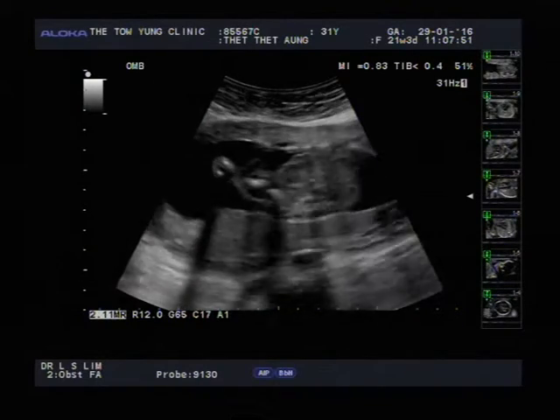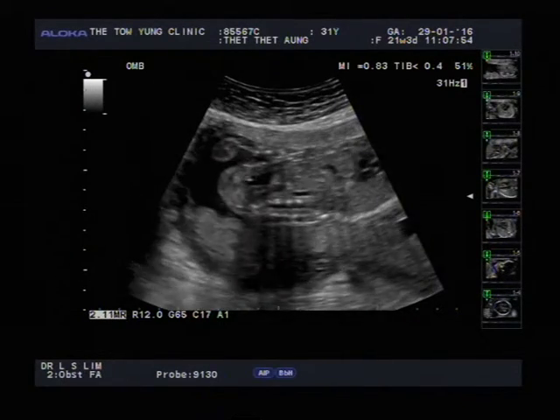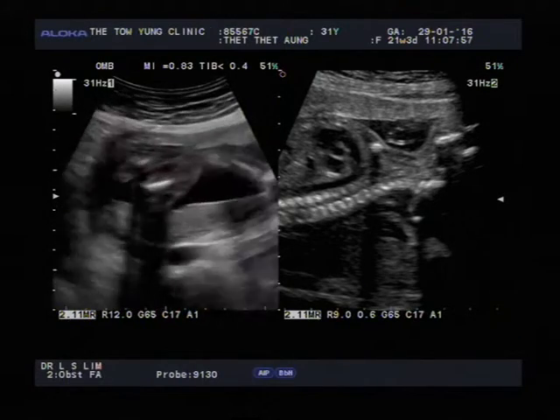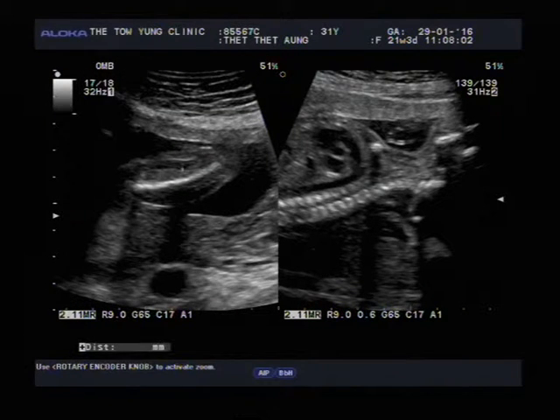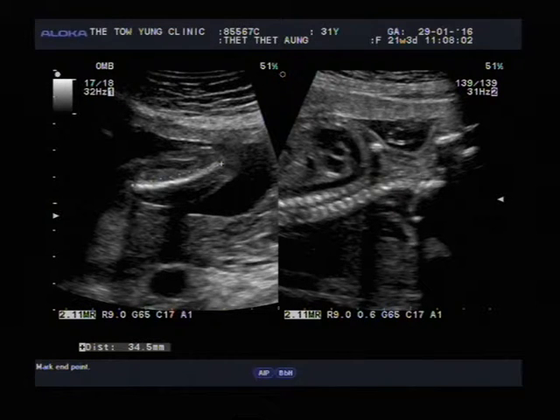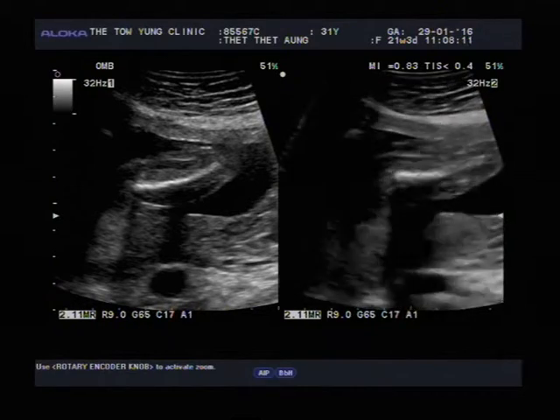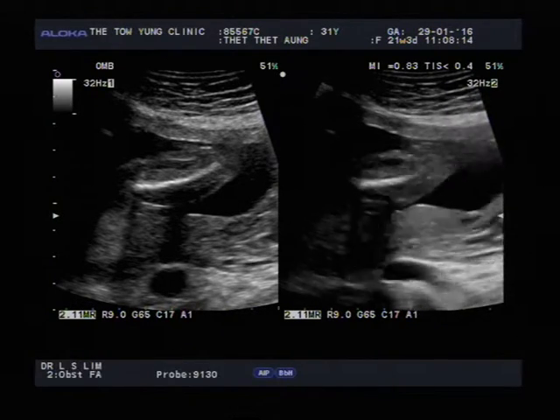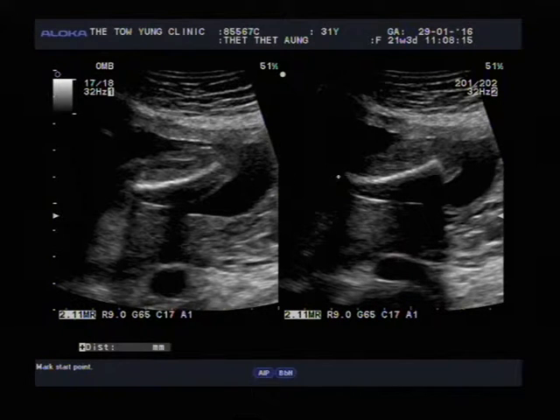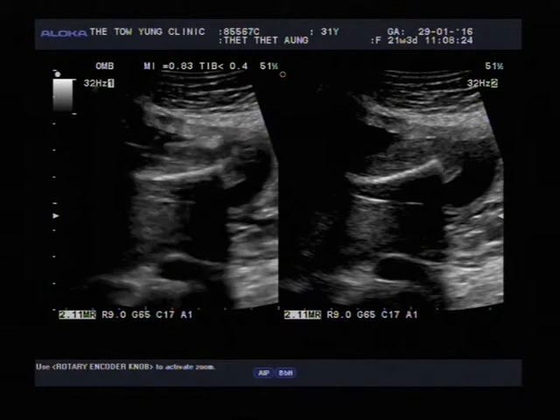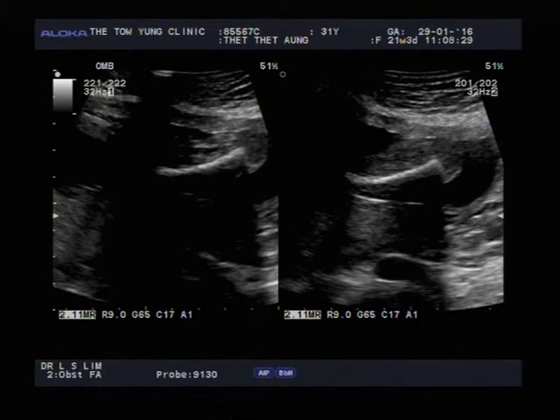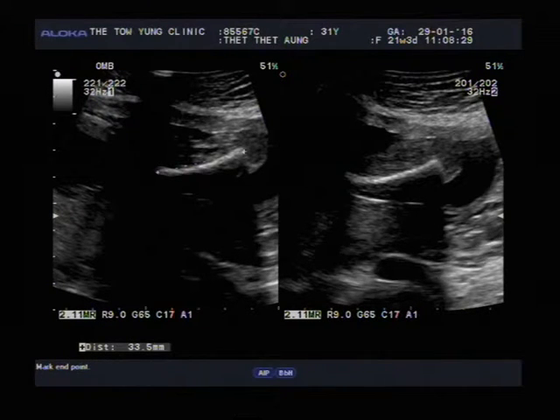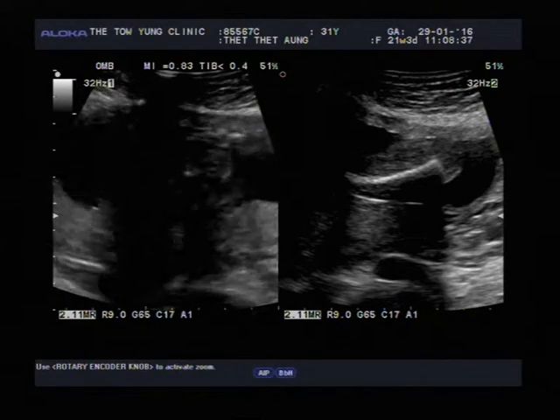Going to the lower limbs — I'm going to split the screen into two and measure the lower limbs. First the thigh bone, followed by the leg bones. Can you see the thigh bone there? This measurement from the hip to the knee — let's get the full length of the bone. From here it looks like the right thigh. The measurement is up to 35 millimeters. Then from here we go to the leg measurements — that's 34. The leg bones are below the thigh, below the knee.